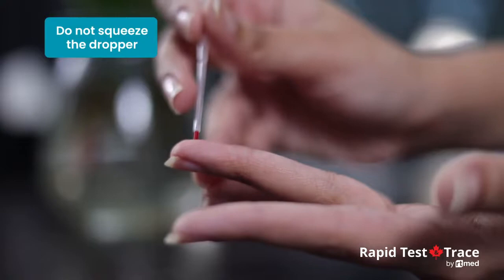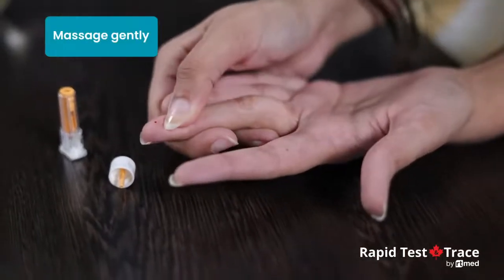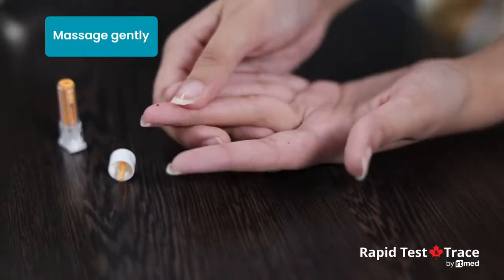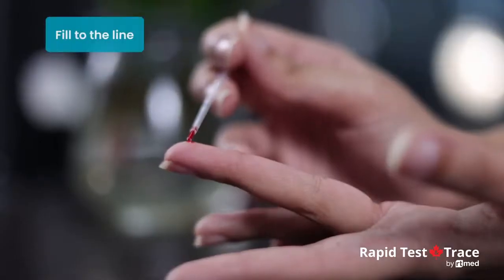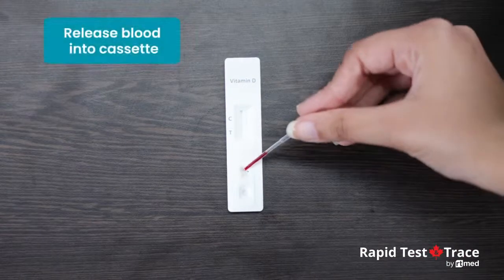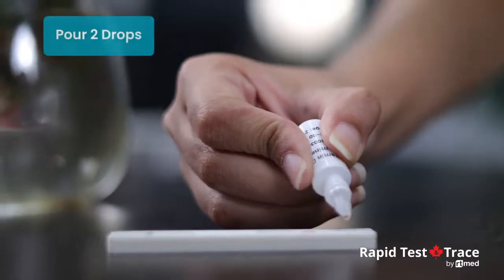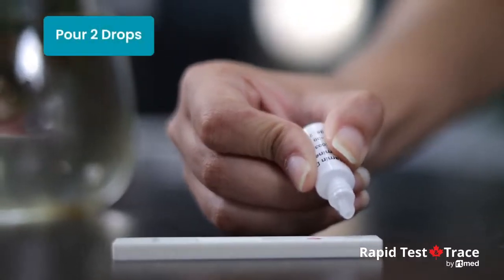Without squeezing, put the capillary dropper in contact with the bulb of blood. You may massage the finger to obtain more blood in case it doesn't reach the indicated line — avoid air bubbles. Release the blood collected into the specimen well of the cassette by squeezing the dropper, then add two drops of buffer into the buffer well of the cassette.